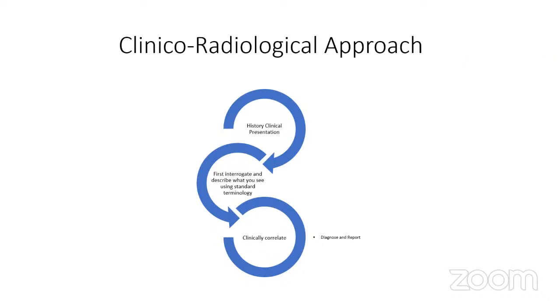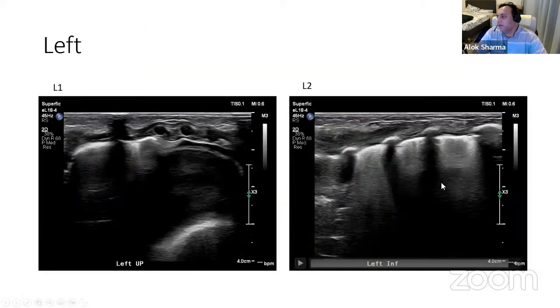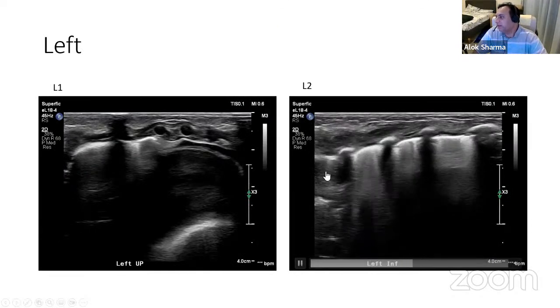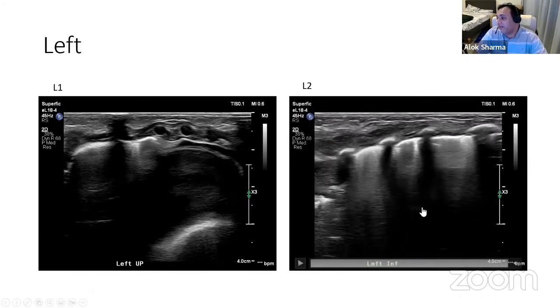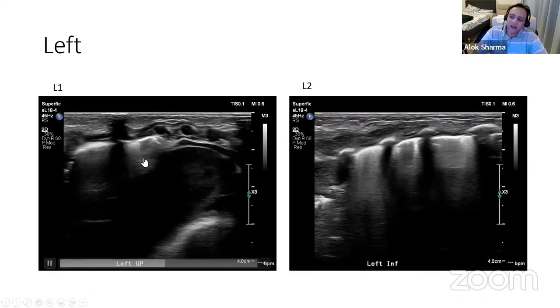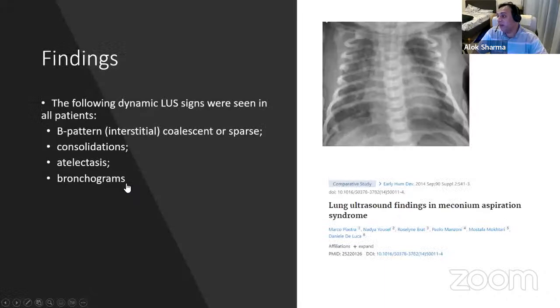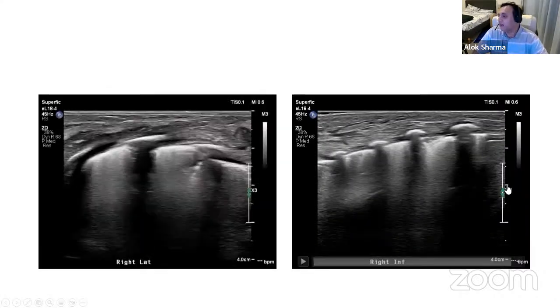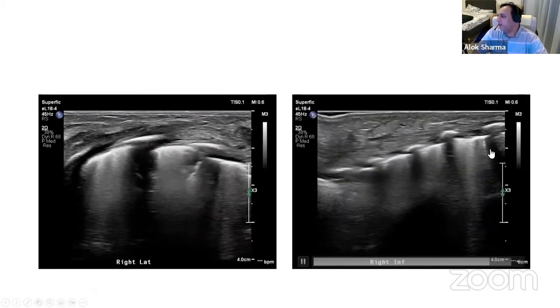In the scans, the focus was low. It was on purpose. Yeah, because I'm looking at the deeper part of the lung because I want to look for consolidation. So unless I keep the focus low, my pleural margin is where the focus will be, and I'm not going to get a very nice tissue sign. Can you see what a nice tissue sign this is? So I've kept the marker at that level. Again, what I'm trying to do at this particular point is interrogate for consolidations, because this is a baby who I think clinically has got meconium aspiration. And really, I can see the sliding in the pleura anyway, even with that.